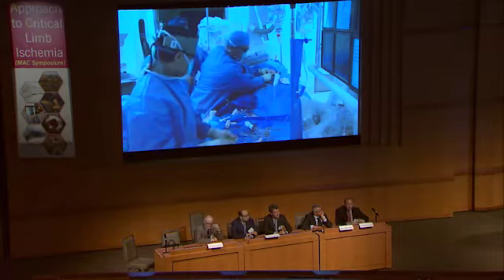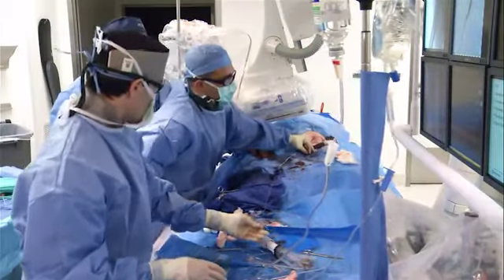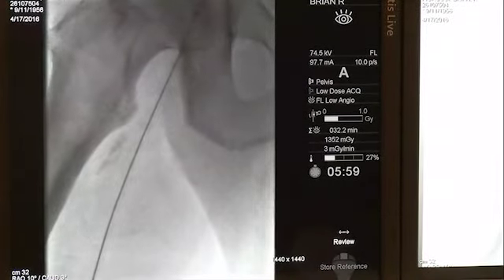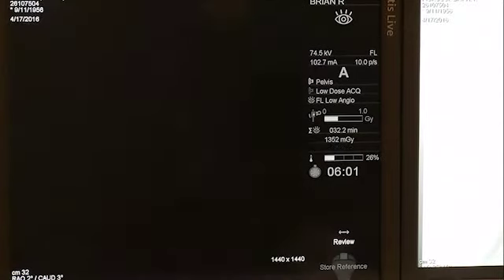Can I have another stiff angle glide wire? Absolutely. You should at least introduce the dilator before you pull the sheath back. Yeah, at a minimum, a dilator. Maybe even a balloon distal sometimes. Can I get that 5 by 150 balloon? Let's go. Open it, please, Annie.